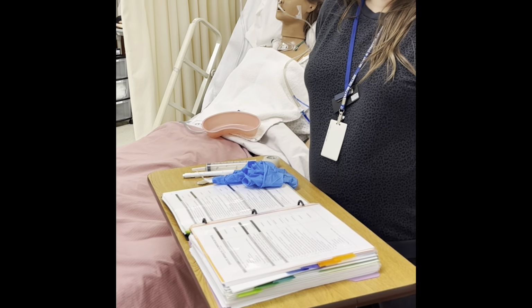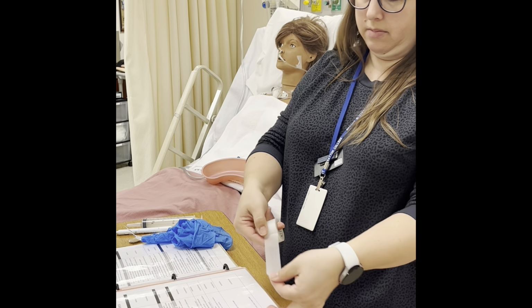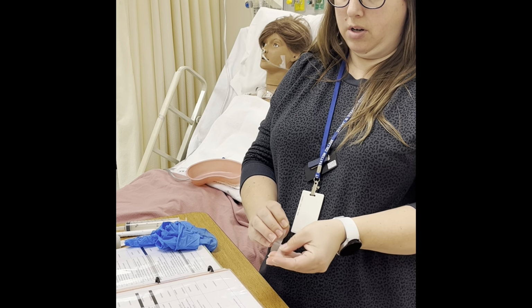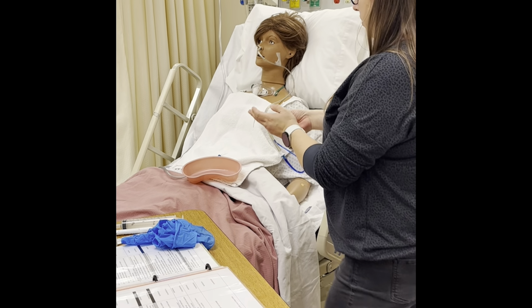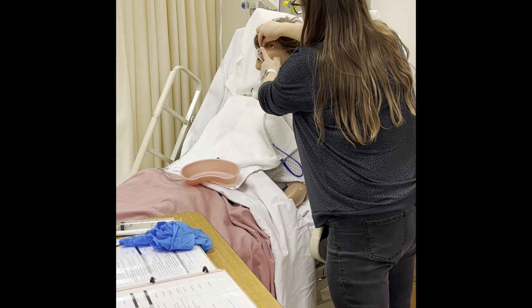Now we want to anchor the tube using the PANTS method. So we're going to take our tape, about 2.5, 3 inches. Do you want a longer piece of tape? We're going to cut it down the middle. So we're making like a little pair of pants. We got a top and 2 legs. The top part, or the waist part, is going to go on top of the bridge of the nose.